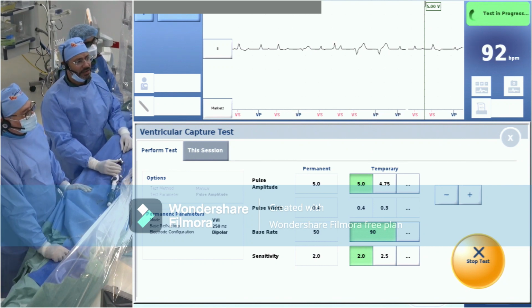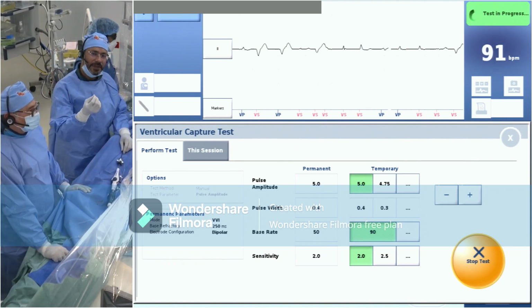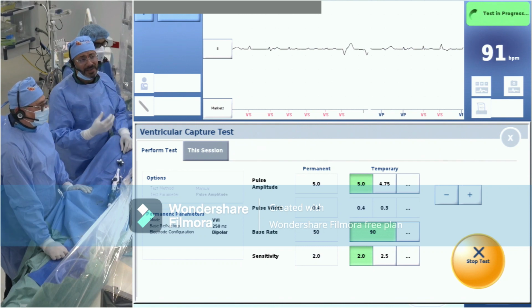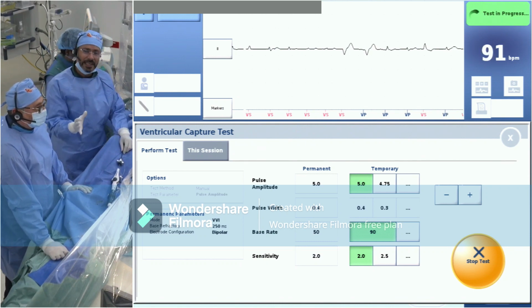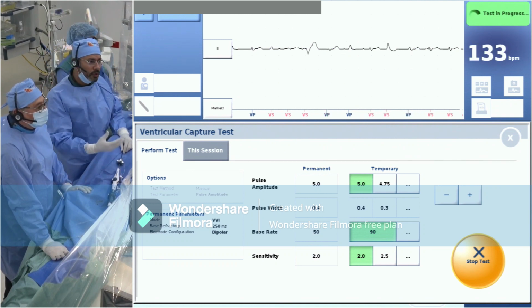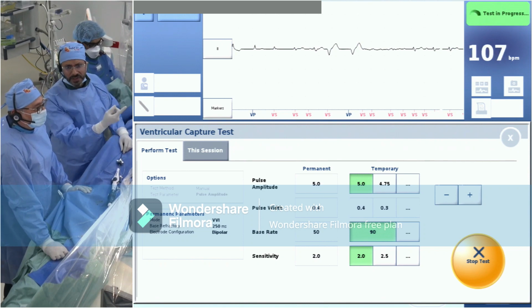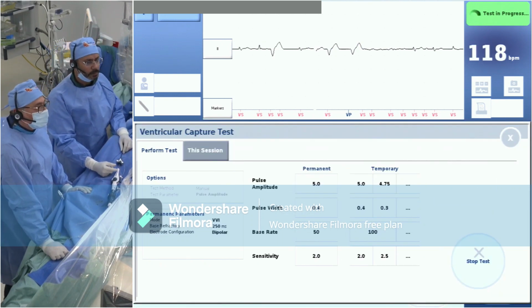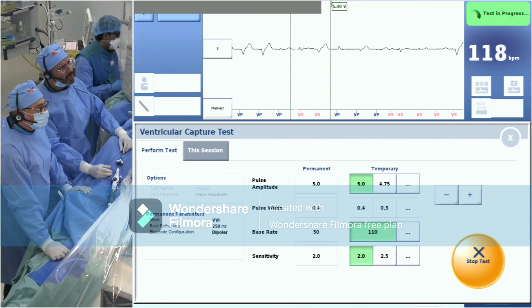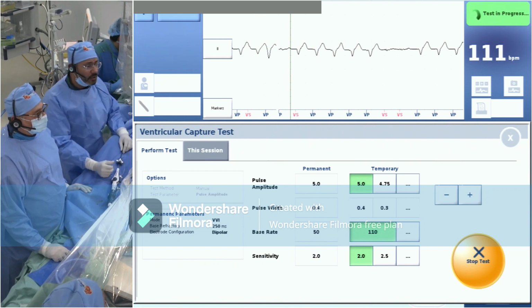The most challenging thing when we choose this technology is that usually you are choosing it for an elderly, frail patient, and this is very stressful, to be honest, because you're doing the procedure and the patient has multiple comorbidities. It's not like putting a device in a completely healthy patient with completely healthy anatomy. So that makes it a little bit challenging. But of course, when you do more cases and learn from them, we will gain more. I think we need to increase the rate again because he's 100 now. Yes, please, because he's moving a little bit, so his heart rate is building up. Now it's pacing. When you increase the rate to 110 intermittently, because he accelerates in between, it's capturing. It's good.